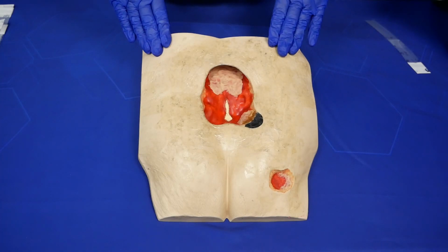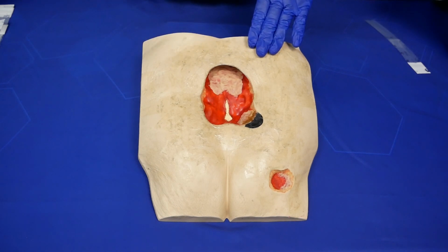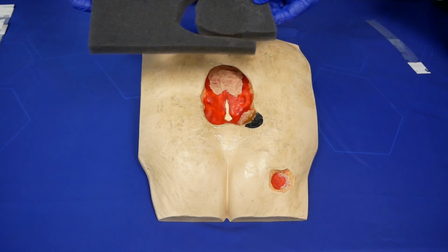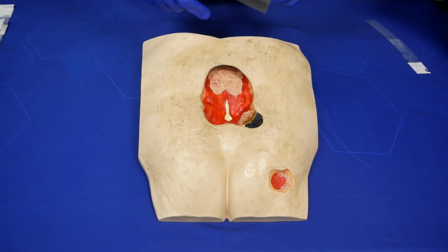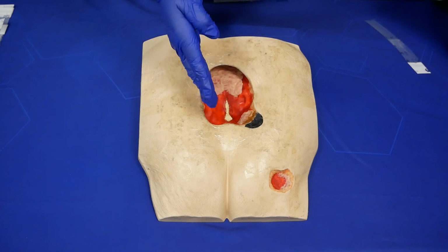Now that our peri-wound has been protected with our drape, it's time to apply our foam. So I've got a pre-cut piece of foam here that we are going to use to put inside our wound bed. The foam should be cut in a size where it covers the entire wound bed, left to right and top to bottom.